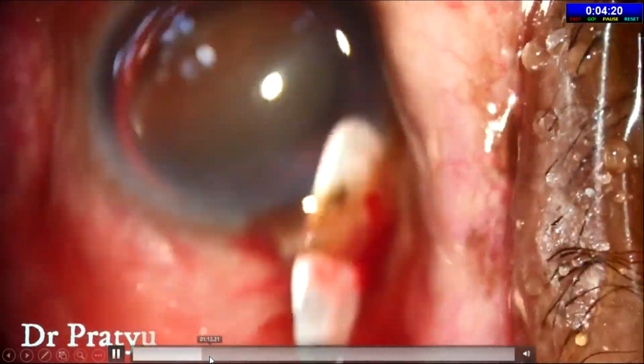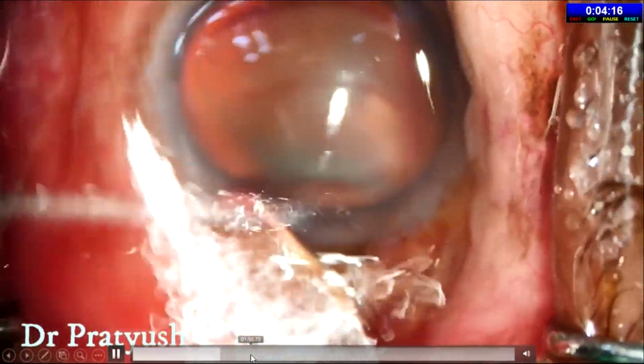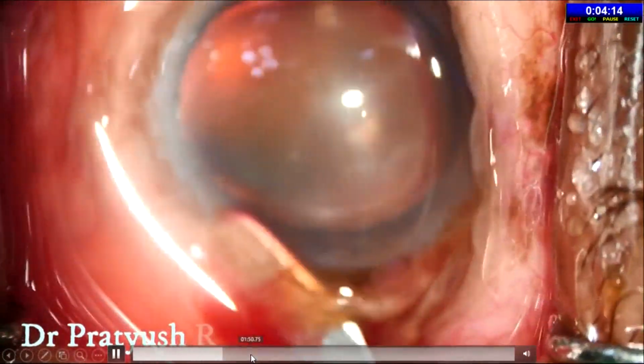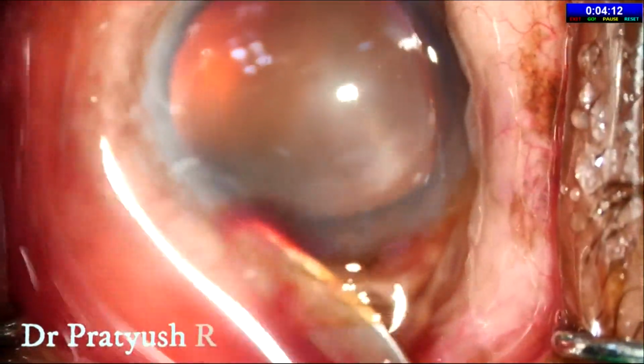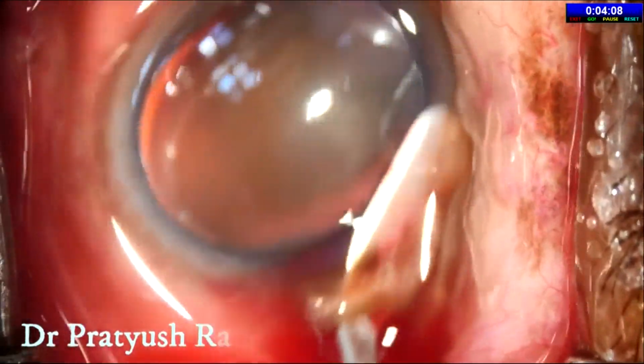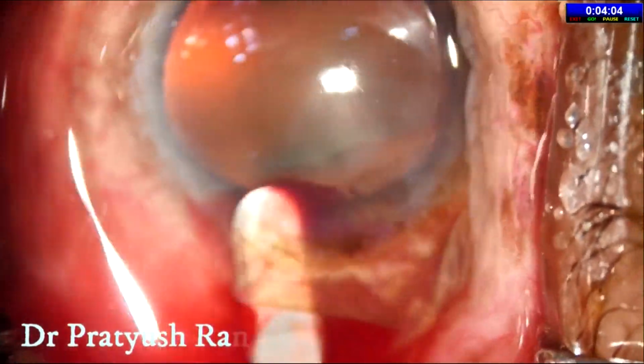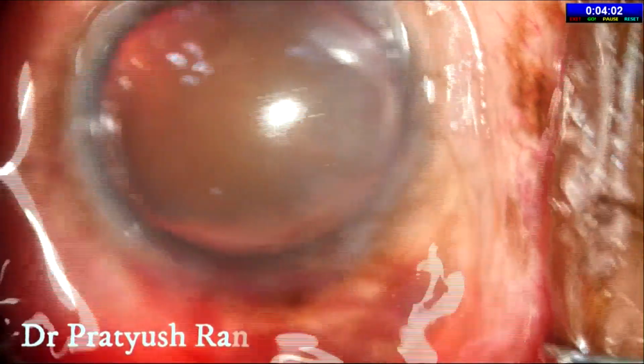So I would just fast forward it a little bit. Pockets should be well made in SICS because it's a snake mouth kind of tunnel you are trying to create, in which the inner pockets are larger than the outer incision. So this is the pocket making.